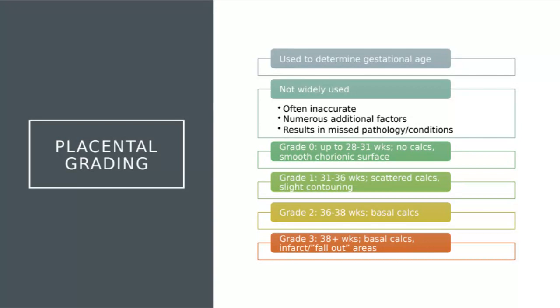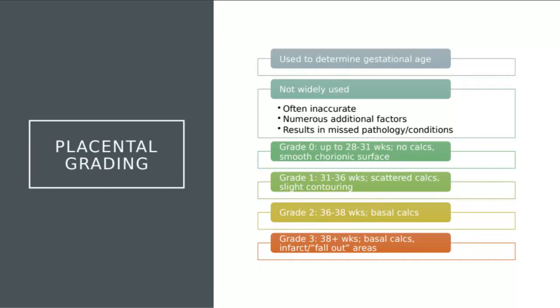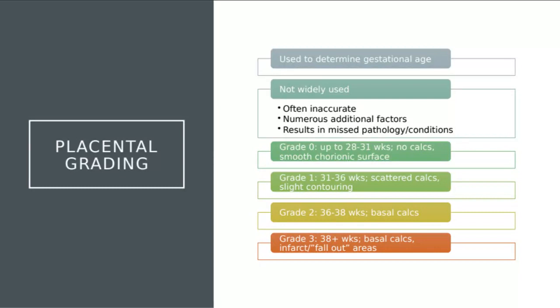We don't really use this, especially in the ultrasound world. This is something that is going to be used maybe by OBs, depending on how closely they use ultrasound in their practice, but this is not something that if you're working in a radiology department or in a hospital, you're really going to be doing. Some people do use it to help determine gestational age. This is really only going to be helpful for a woman who has not gotten any prenatal care at all. They maybe didn't even know that they were pregnant, and now they're coming in last minute, and you're trying to figure out how far along that baby is. Is it safe for delivery? Is it not? So again, not using this often.